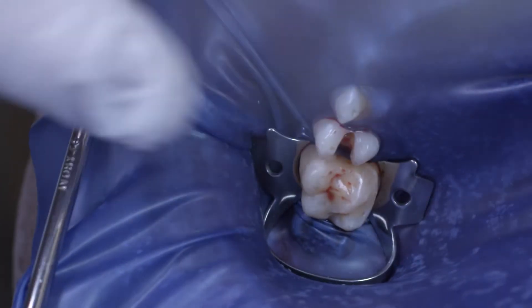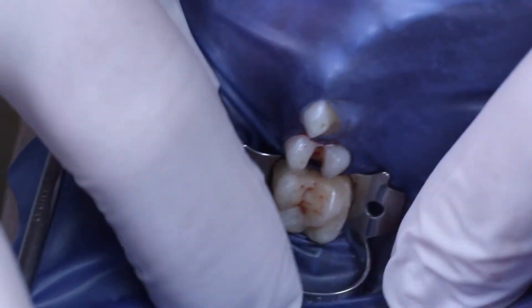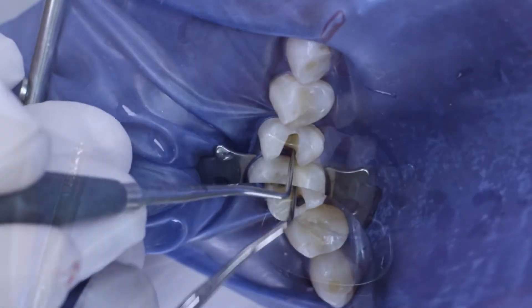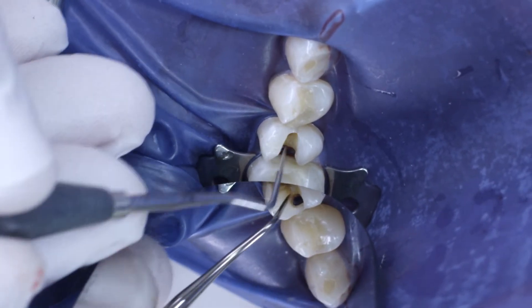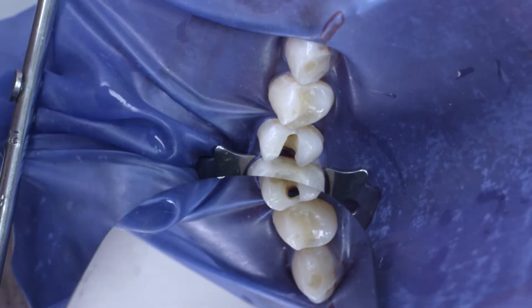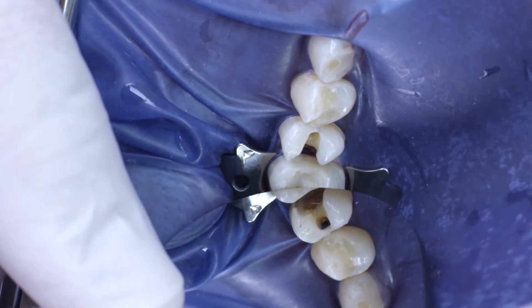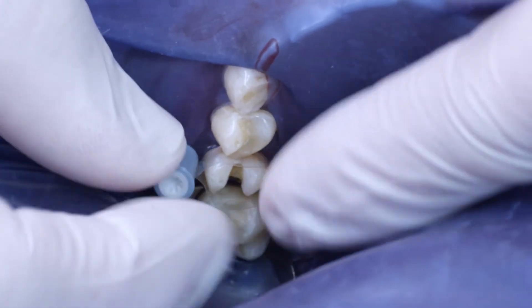Following anesthesia, a rubber dam was placed in position and the amalgam filling and caries removed. As can be clearly seen in the mirror, I performed a tunnel preparation as caries was present in the mesial area. This minimally invasive approach allows the contact point in the area around the ridge of the distal margin to be retained.